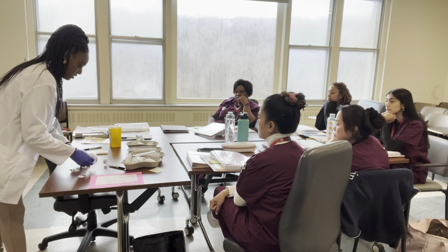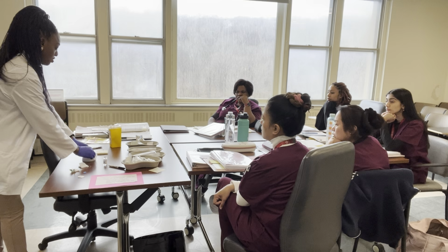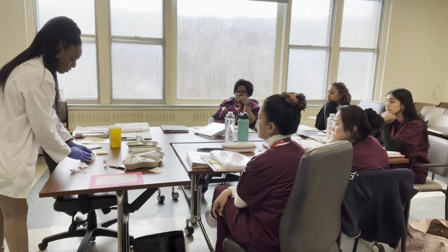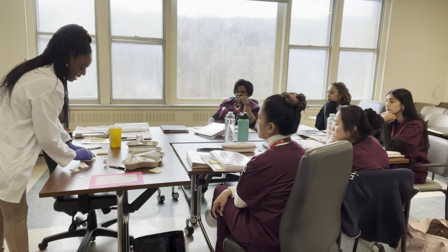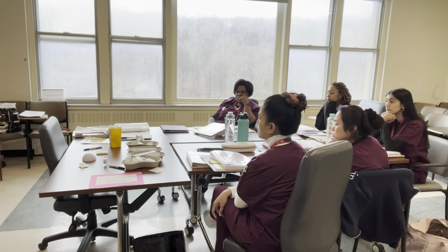Oh, okay, then you would check to see if there's any bleeding. Some people had blood, depending on where they went. So you always have your 2x2 to check. You don't want to get their clothing with blood on it afterwards. You put pressure, it's always pressure. You don't want to rub. Then say thank you, cover them up, and then you throw away your garbage. Is that good? Clear for everybody?